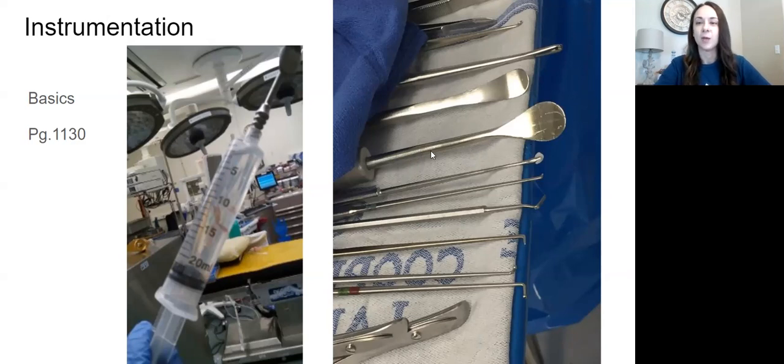After that, I'm going to stop at this Cobb elevator. You should 100% know what a Cobb elevator is before you go into a spine case. That is one of the main instruments they are going to be using. It is an elevator, so they will use it as a Cobb elevator to scrape periosteum. They can also kind of use it as retraction in spine. Whenever I assisted in spine, that's what I did for hours, was hold a Cobb very steadily so that the surgeon could see. So it kind of holds back some soft tissue that maybe the Weitlaner, Adson, Beckman retractors aren't holding back. Sometimes it's also just as they're working. So they'll do a little bit of work and then you get the Cobb elevator and elevate some more. You just kind of go with the flow on that one.